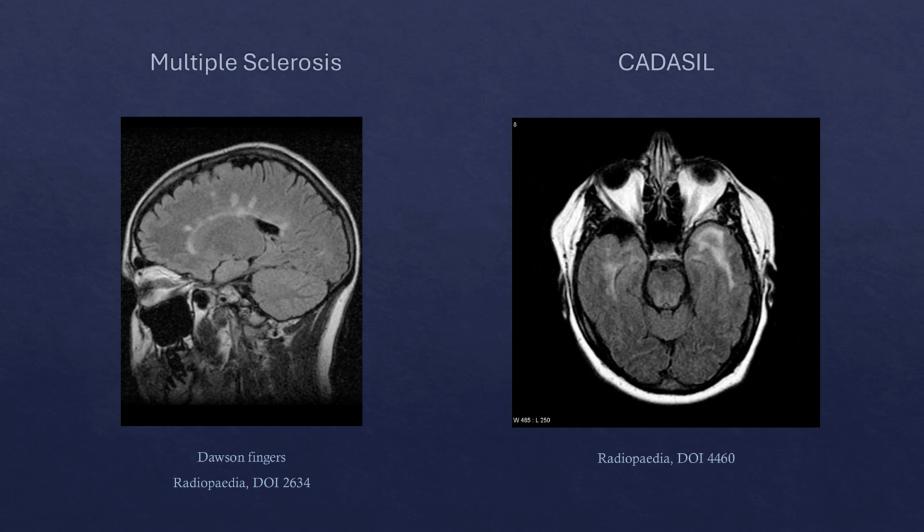Hypertension and diabetes can result in chronic microvascular ischemic changes, which give a similar MRI appearance. However, the extensive degree of lesions in this patient is unlikely to be solely due to chronic microvascular ischemic change, especially given the young age of the patient.